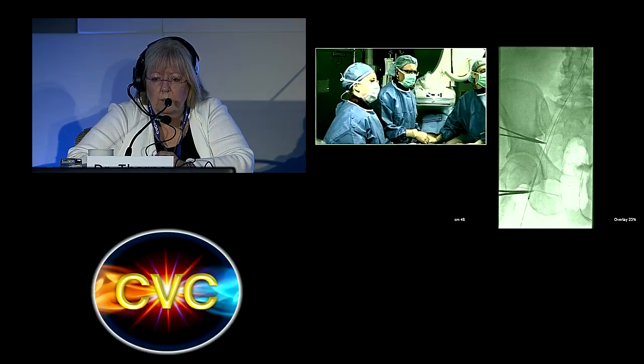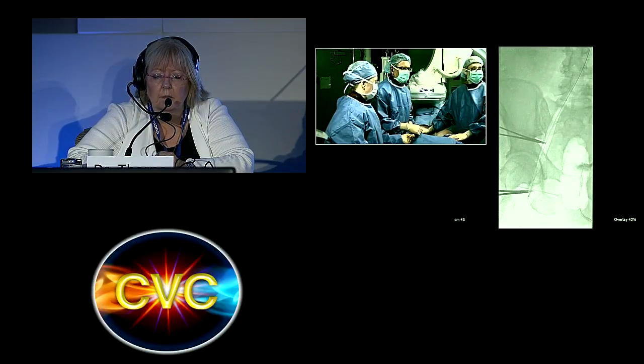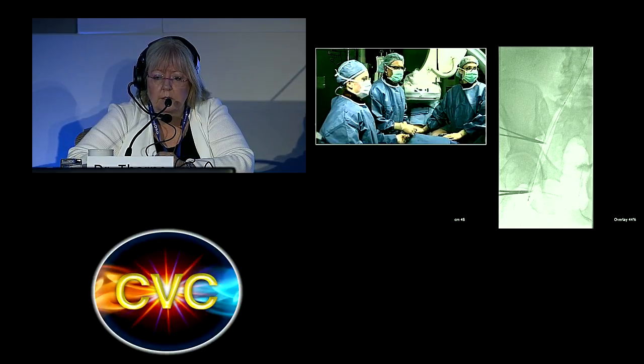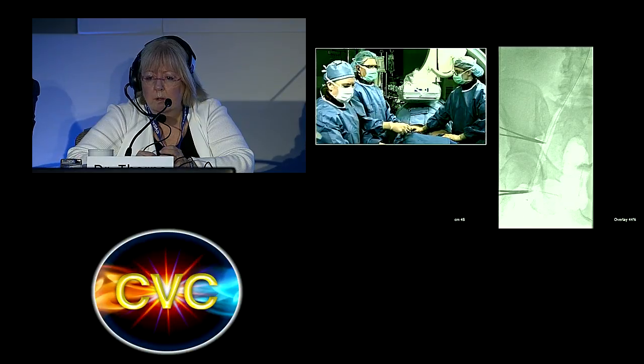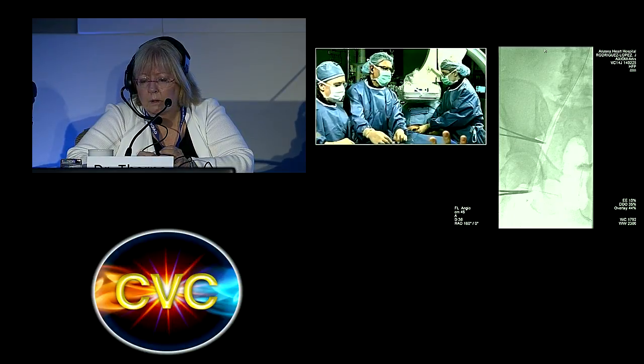Start coming up a little more. I'm going to pull down. Now it's coming up. You're going to end right in the middle of the femoral head. Man, that's an advantage if he needs a heart cath. Here we go. All right, let's get the 40 millimeter balloon and touch that. Yeah, definitely had a significant foreshortening.